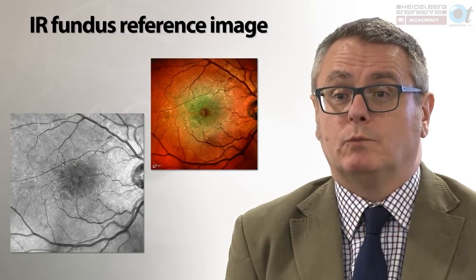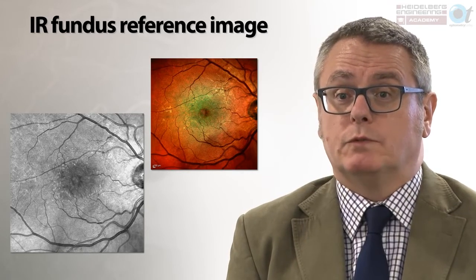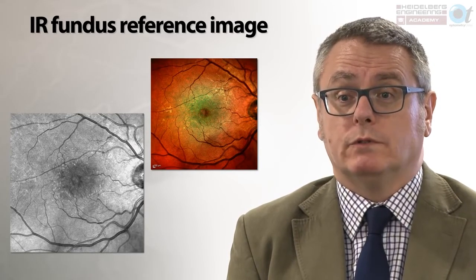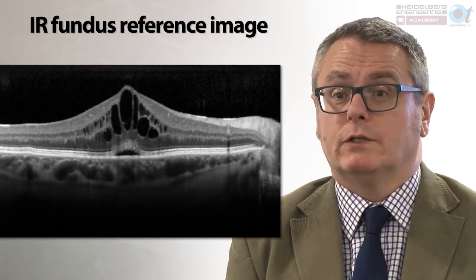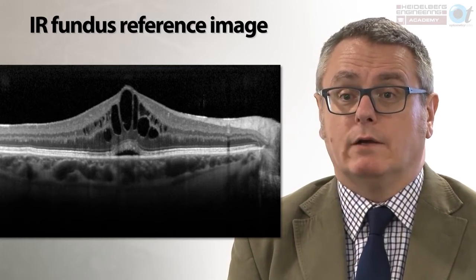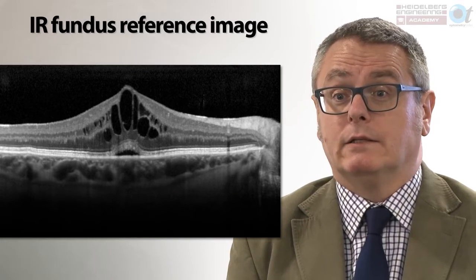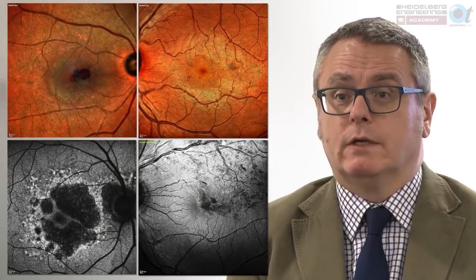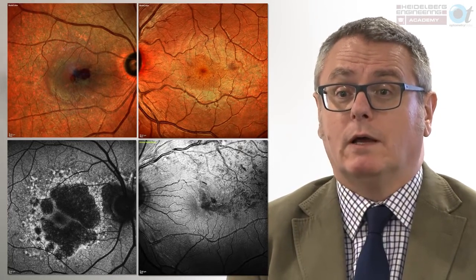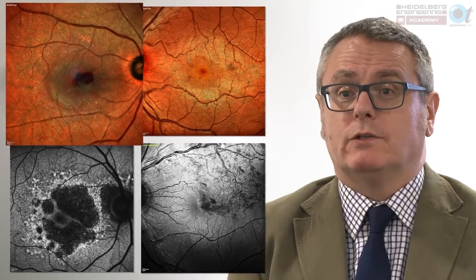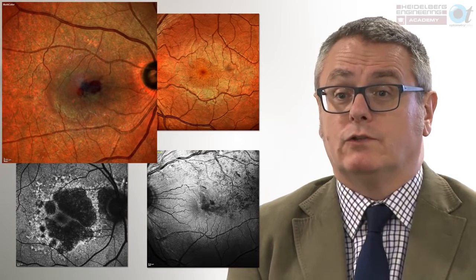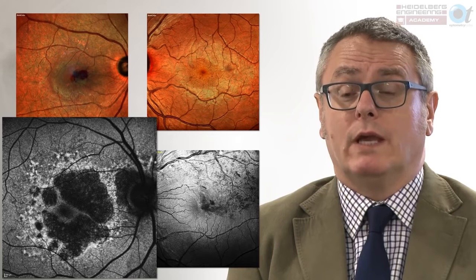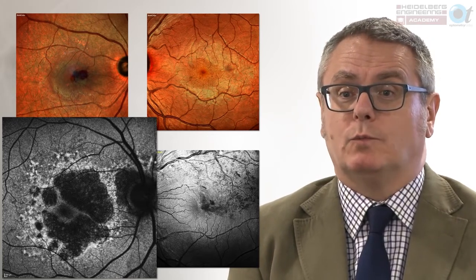Another example in a patient with mild non-proliferative retinopathy who also has evidence of maculopathy. There's a small change on the infrared reflectance image corresponding to a microaneurysm and then generalized absorption of the infrared reflectance centrally. The structural change on the OCT corresponds to the area of absorbed reflectance, and clearly we can see intraretinal fluid and subretinal fluid on the OCT cross-section. Don't forget those basic fundoscopy skills learned as an undergraduate — they apply when using OCT. On an autofluorescence image, changes associated with retinal pigment epithelial atrophy will likely show corresponding retinal atrophy with significant change noted on the OCT scan.